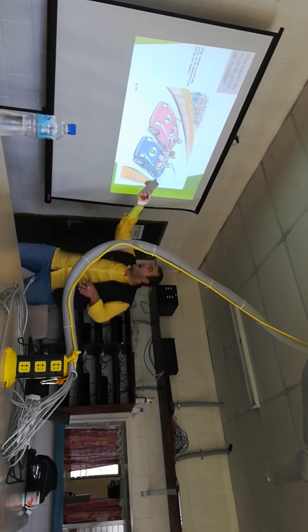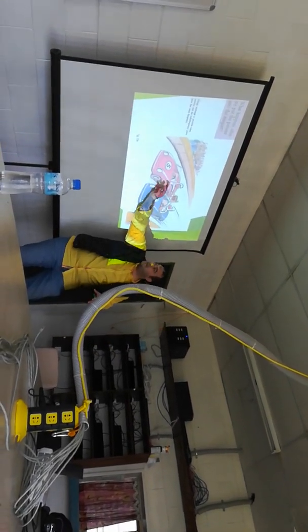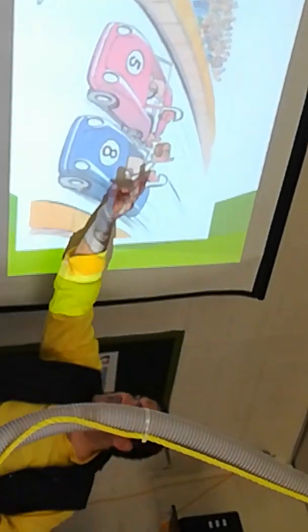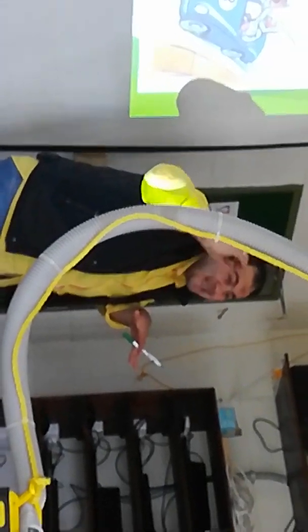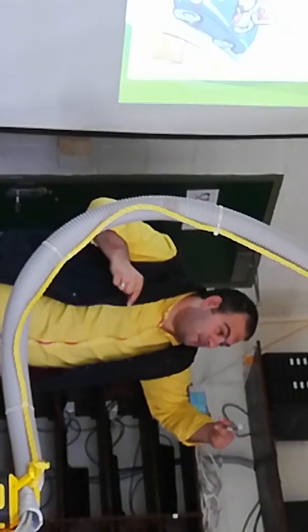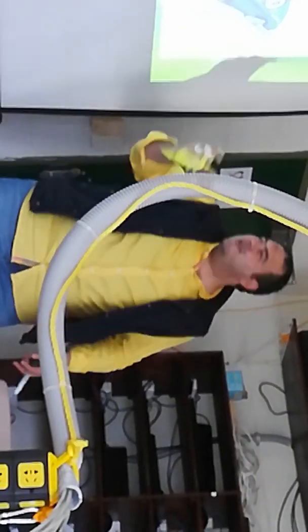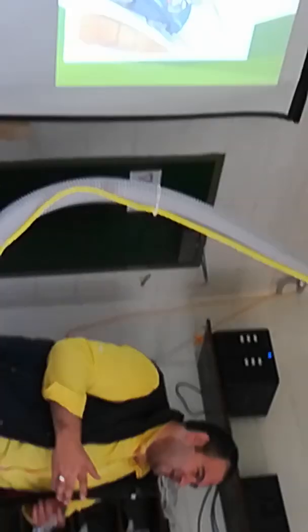Now, 2 cars moving very fast: this is the protons in the magnetic field, and this one is the radio waves, which I want to transfer from the coil to the patient. If the frequency of protons inside the patient is the same as the frequency of the radio waves coming from the coil, the energy transfer will be done so easily.